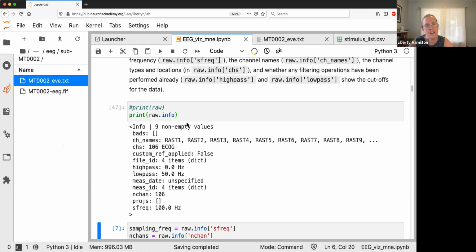And yeah, so I think there's also the cost of setup time. Depending on the population that you work with, if you are working with patients or children or older adults, you may want a lower number of channels so that the setup is faster and they don't get too tired. But some of these setups are also quite quick to set up. So your mileage may vary, I would say.